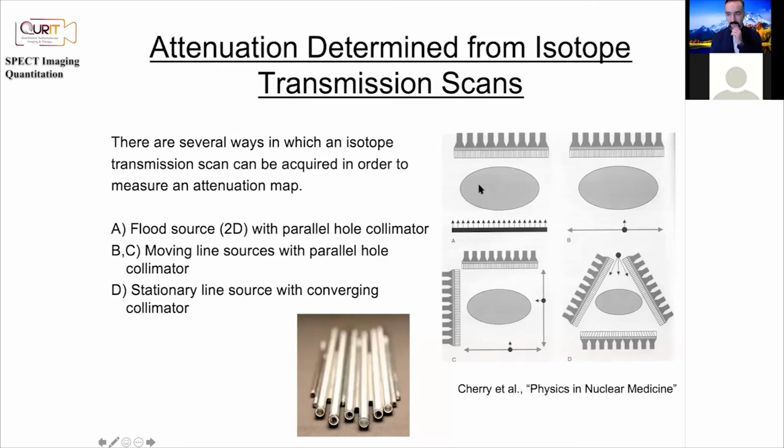But before CT was used, commonly, if people wanted to do proper attenuation correction for SPECT, they would be using transmission sources. There are different ways of doing this, but essentially, you had a radioactive isotope that would be effective, kind of like doing a CT scan, but you would get lower resolution scans and it would take longer to do the imaging. So it's almost like a lower quality CT scan.